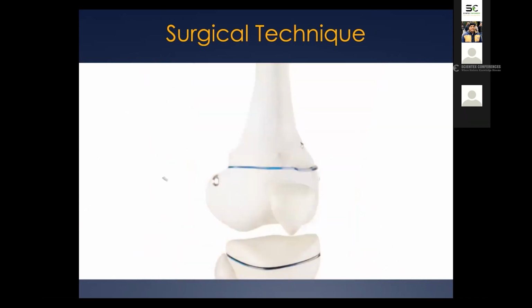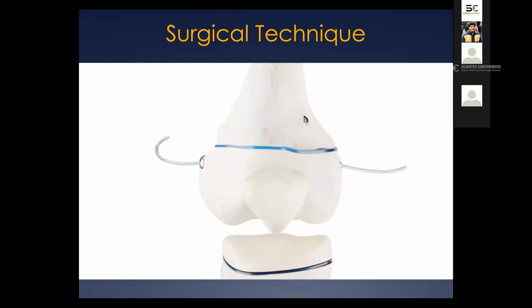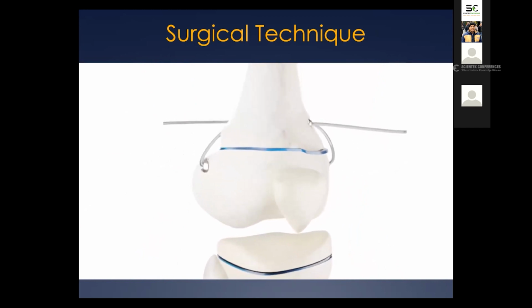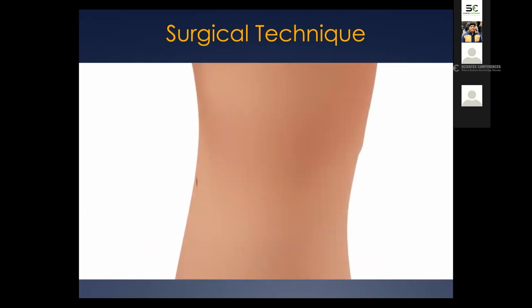Then 2 self-tapping screws were inserted. A 1.5 millimeter cable was passed all the way through the epiphyseal canal. The cable was then passed subcutaneously to enter into the metaphyseal screw canal on either side.